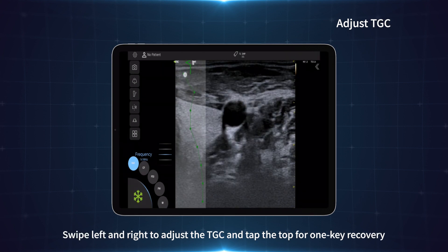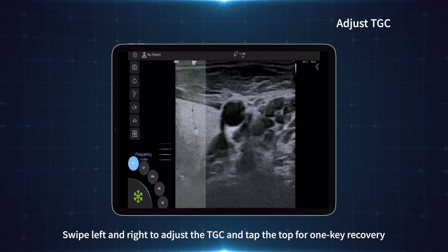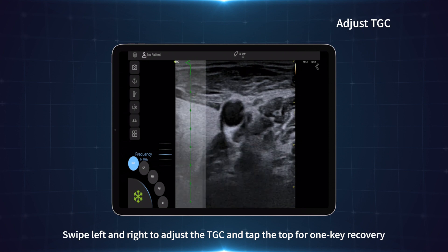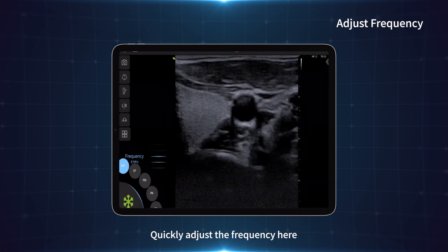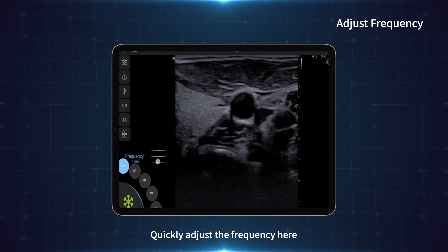Swipe left and right to adjust the TGC, and tap the top for one-key recovery. Quickly adjust the frequency here.